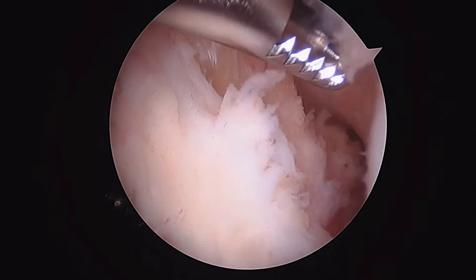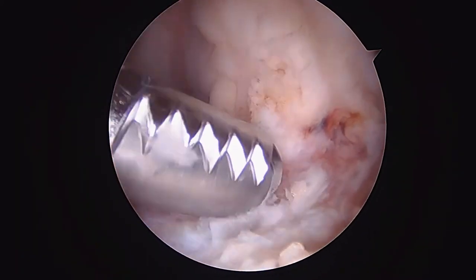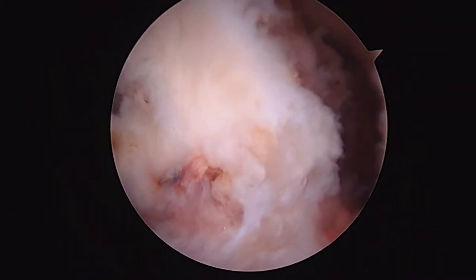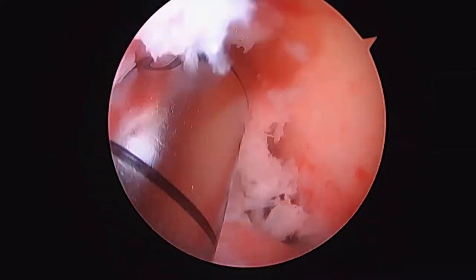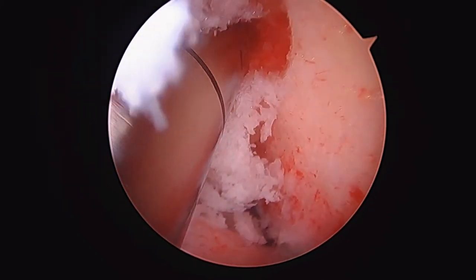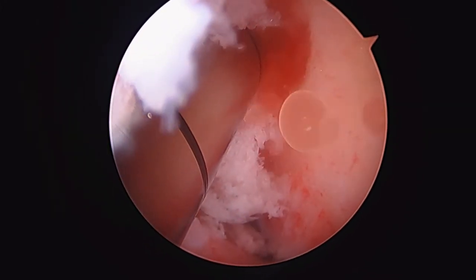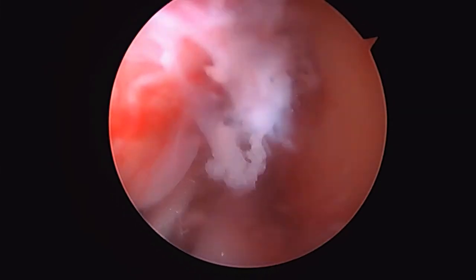We've repaired the medial and lateral meniscus and done a patellofemoral chondroplasty. Now we're about to work on making a tibial tunnel — right at the tip of that shaver — then a femoral tunnel, and then we'll pass the graft. What we're showing you now is our drilling into the femur; we've already made a tibial tunnel. We're going to take this to a depth of about 35. That's a good tunnel. You have very robust hamstrings — you've got a 9mm tunnel here.